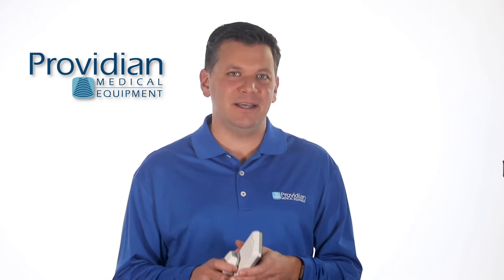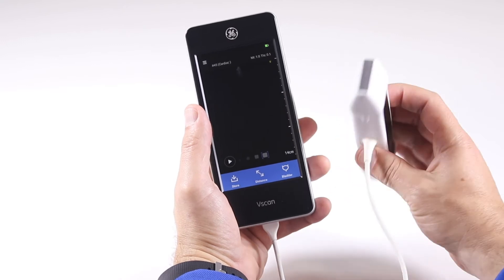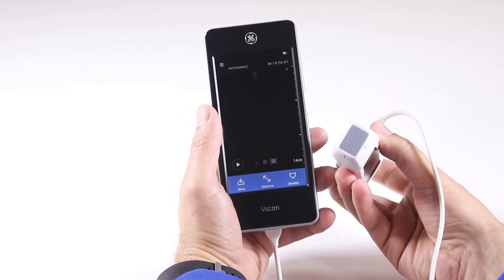The versatility of this is due to its dual probe technology. The Xtend with dual probe has a linear probe on one side for superficial imaging, and the other side is a sector probe for deeper tissue.